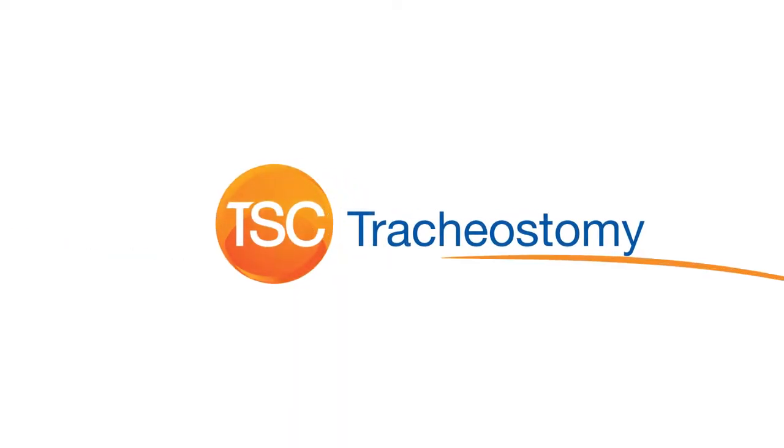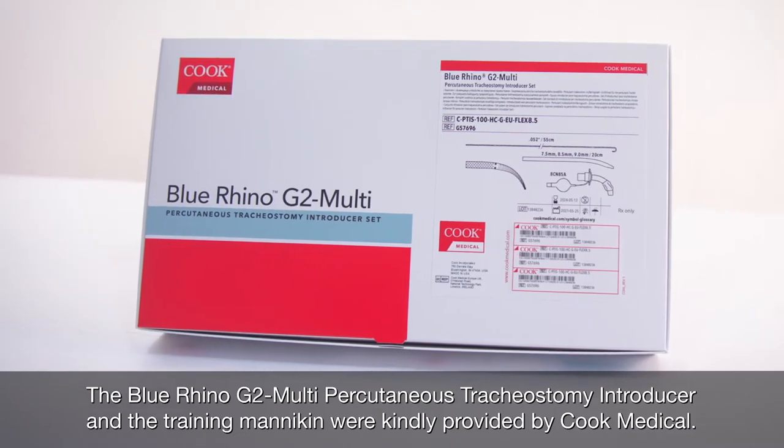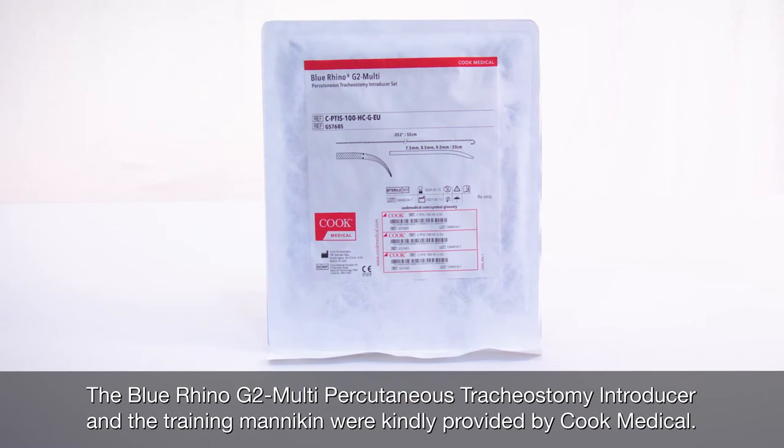Tracheostomy can be considered in patients with acute respiratory failure who require prolonged mechanical ventilation. The percutaneous technique can be performed quickly and safely at the patient's bedside.